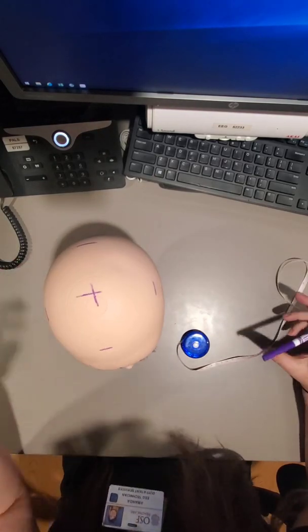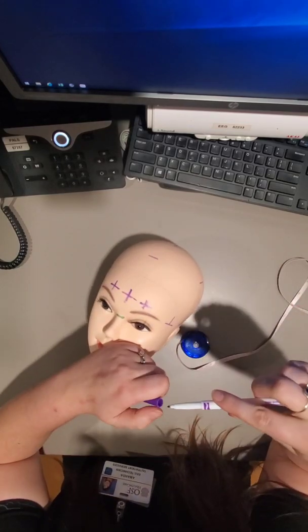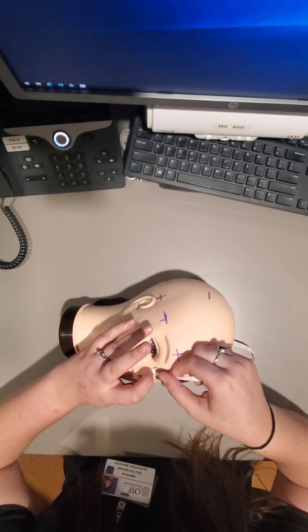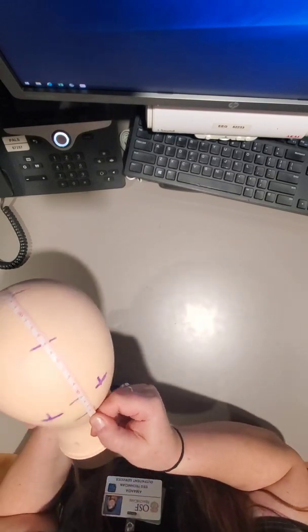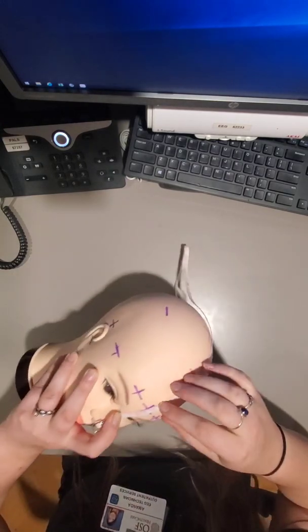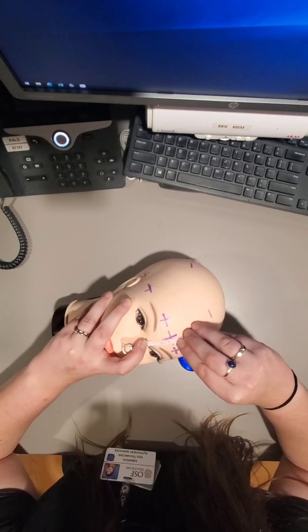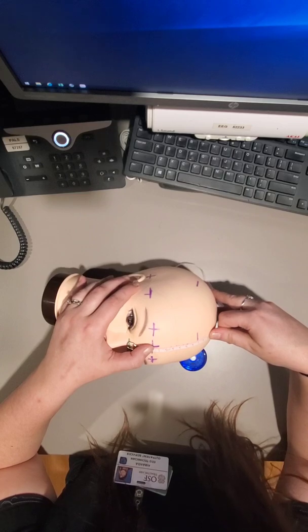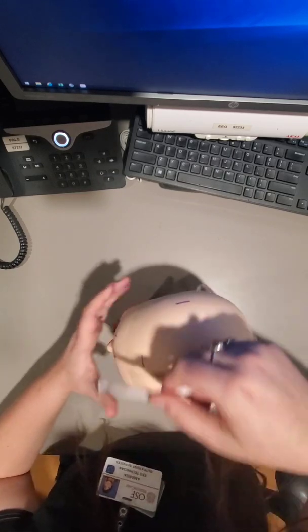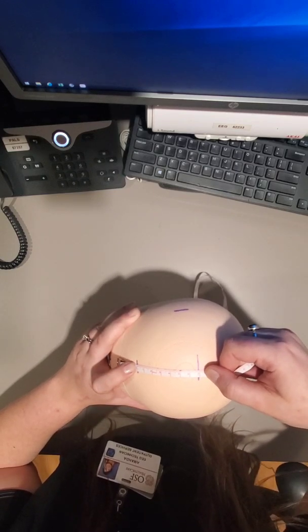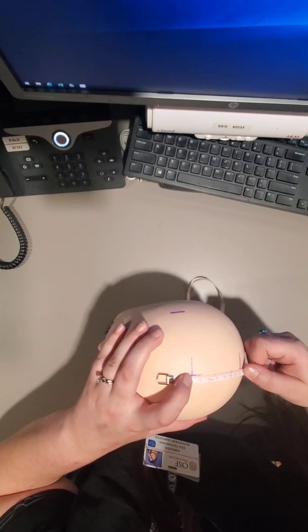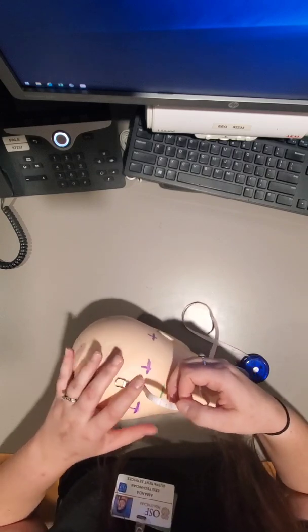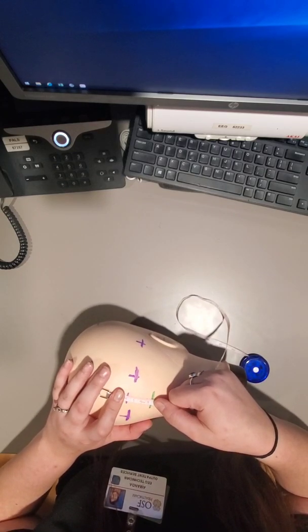Now it's the circumference, the pre-auricular, and the nasion. And then I'm going to go over my measurements. Nasion to inion, 34. So then nasion to FPZ will be 3.4. FPZ to FZ, 6.6. FZ to CZ, 6.8. CZ to PZ, 6.9. PZ to OZ, 7. OZ to the inion, 3.3.